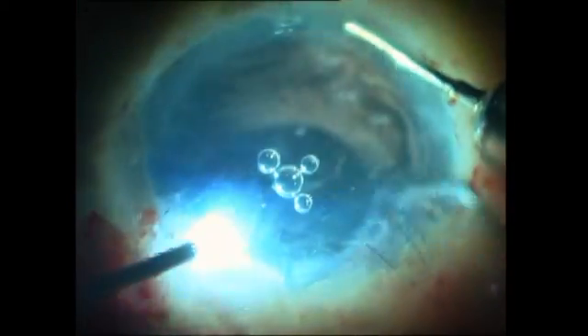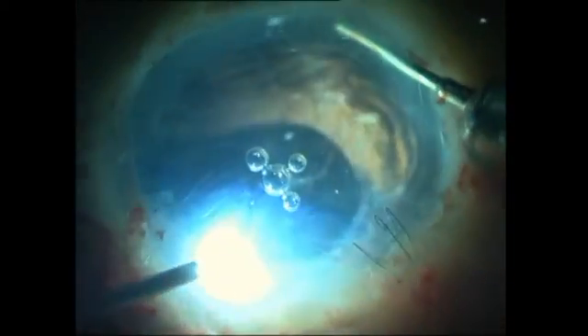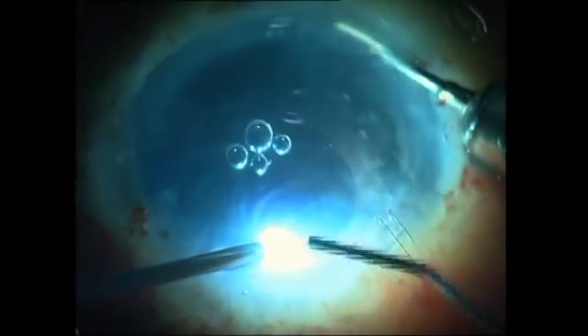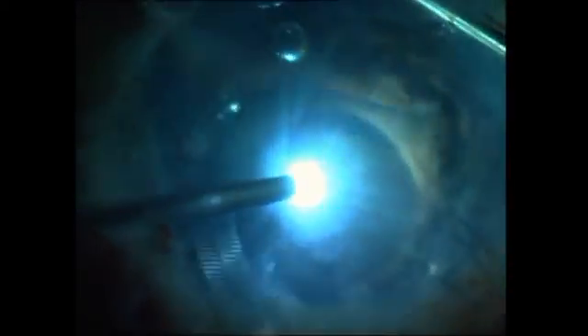When I look at the anterior chamber I'm in for a little surprise, because I see a vitreous strand there. I attempt a vitrectomy first, but because of the risk of the graft getting aspirated into the vitrector, I decide to abandon that and instead use the vitreous as my friend — as a scaffold over which I can unfold the graft much more easily.